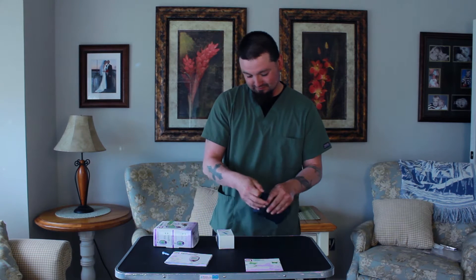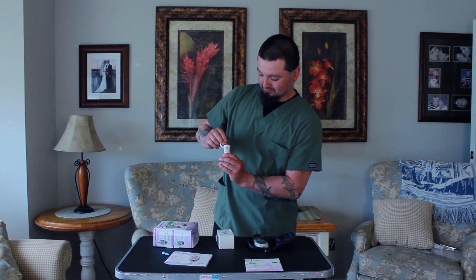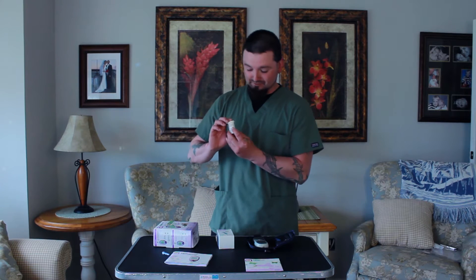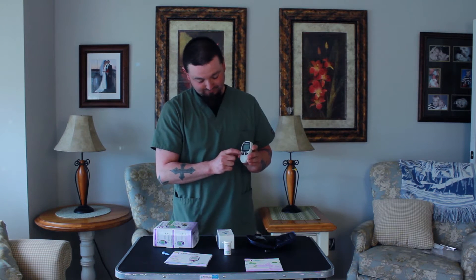Inside your kit there are strips that we use to test. There are about 50 inside each container, and each container is very different. There are numbers on here specific towards dog or cat. You have a monitor that you'll turn on and at that point you'll adjust it accordingly to your strip.